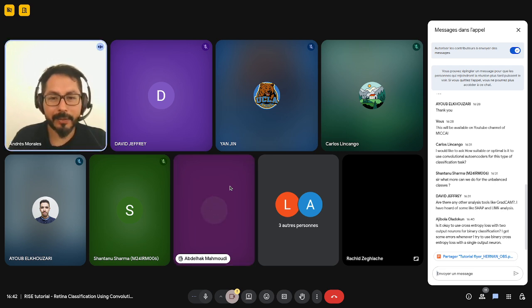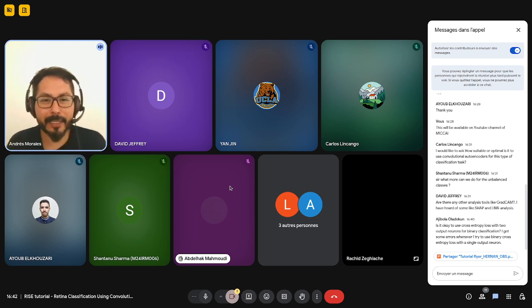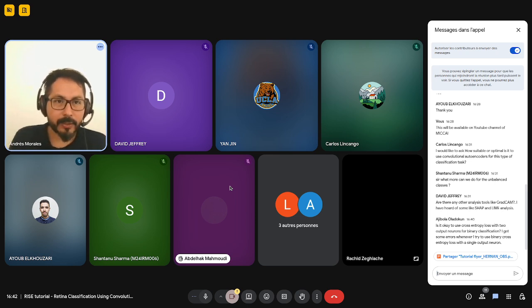Thank you. Okay, cool. Thanks for the questions. They are very, very important. I will start with the second one, about augmentation, and then we go to the imbalance. Which augmentations to use and which not to use depends a lot on the problem that you are working on. For example, if you have X-ray images from the chest, you cannot apply the same data augmentation as if you are using retina.